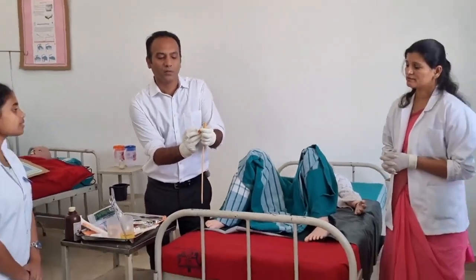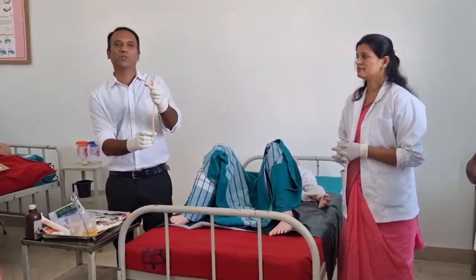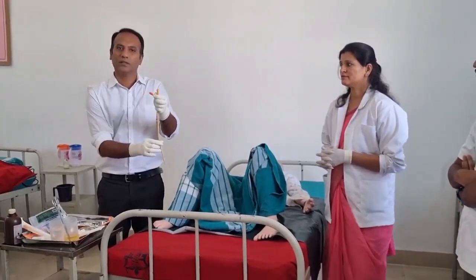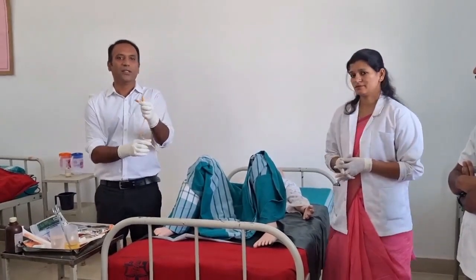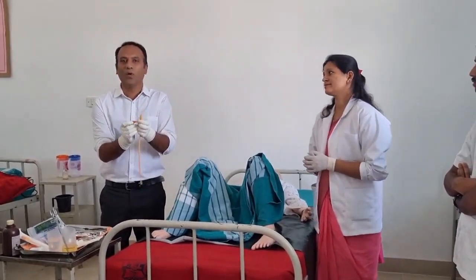The 5 ml is the capacity of the balloon which is going to inflate. The inflated balloon retains the catheter inside the bladder, so it is also known as an indwelling catheter. It is named after the American urologist Patrick Foley.